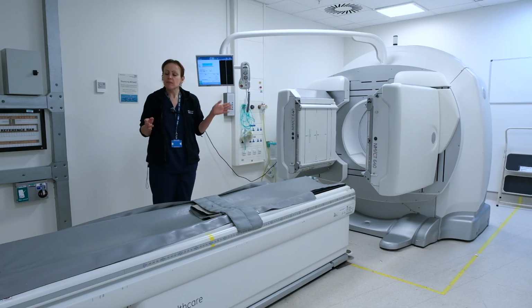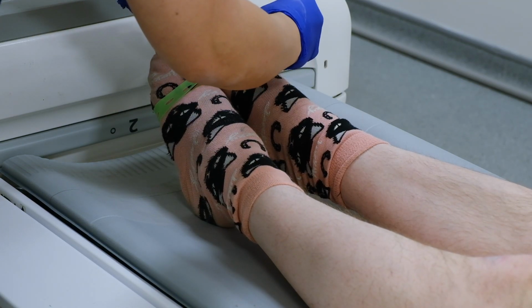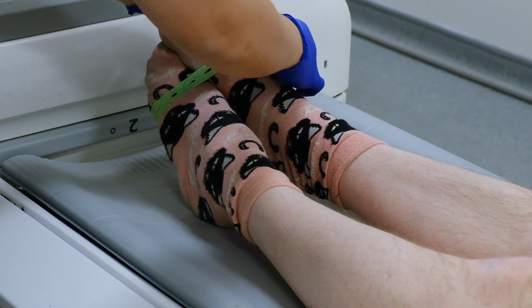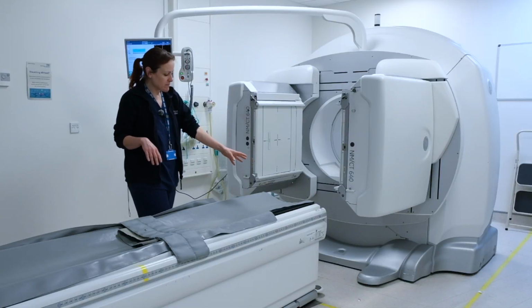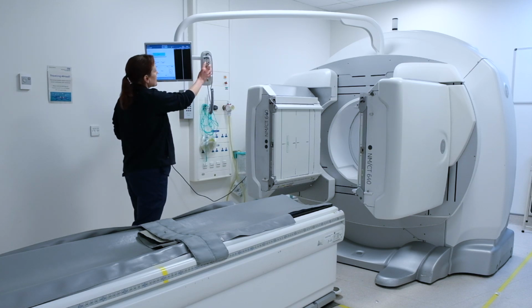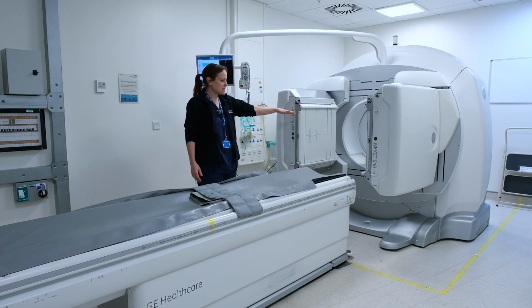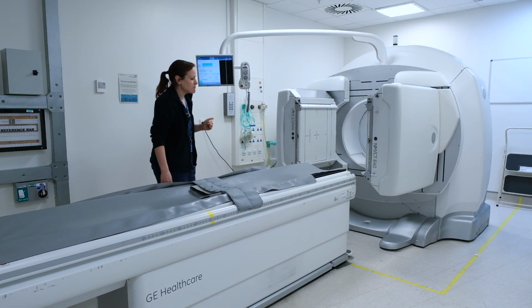We also get the patient to remove their shoes, and we try to position the patient in a pigeon toe position, so as though their feet are out and their toes are touching. And we tend to put a strap around the feet to help them maintain that position. We then press set on the camera, which raises the bed, and then the bed moves into the camera and the camera heads rotate around.